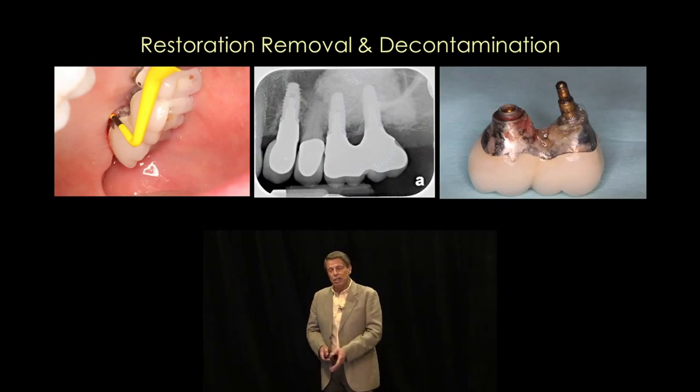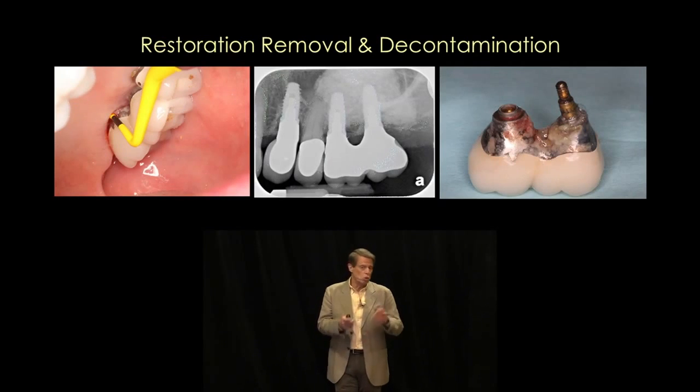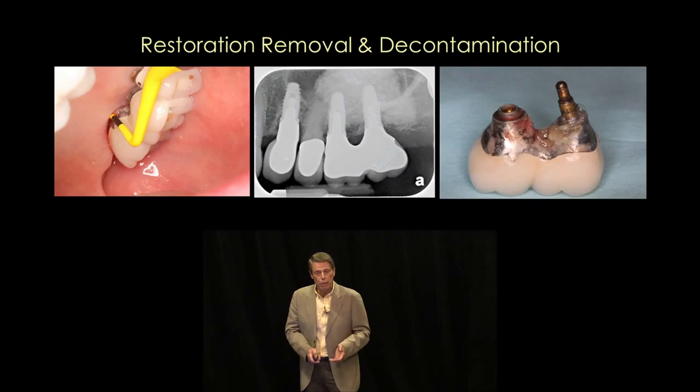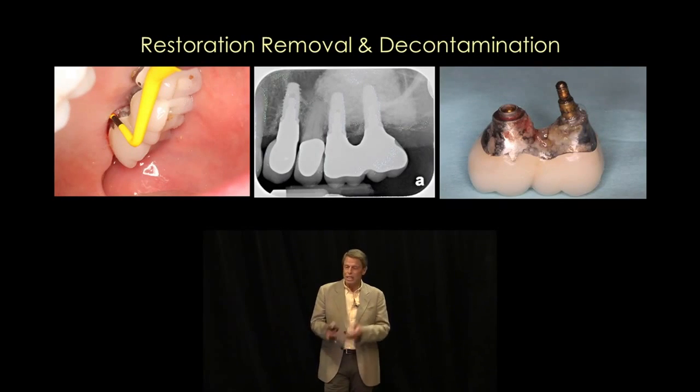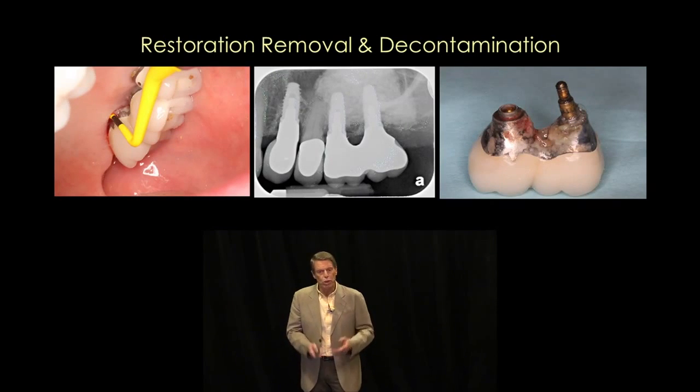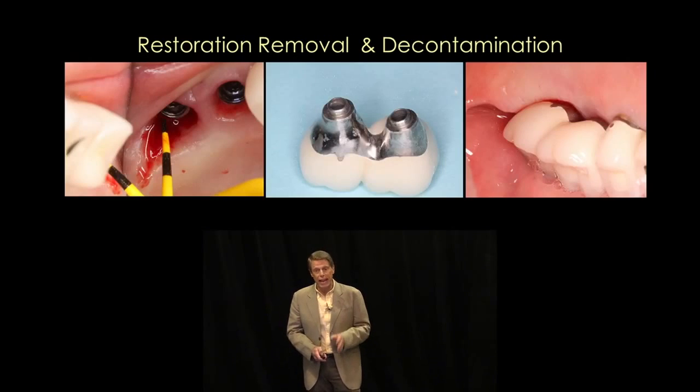And you can take a look at the x-ray, and that's the sinus lift that you're looking at there. But you can see there's really been no bone loss around that implant, but there is 8 or 9 millimeter pocketing. So we remove the implant restoration and take a look at what's happening underneath that implant restoration. Look at all the plaque and debris and calculus sitting on that tissue. This is a nightmare waiting to happen.